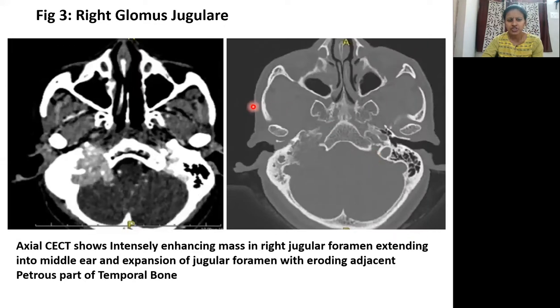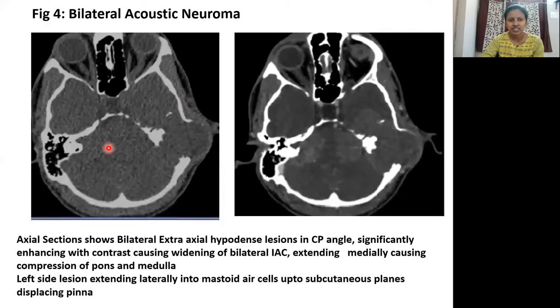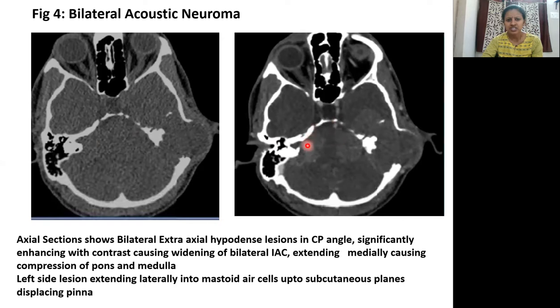This is a case of right glomus jugulare. In this image, we see an intensely enhancing mass in the right jugular foramen extending into the middle ear, and expansion of the jugular foramen with erosion of the adjacent petrous bone. This is a case of bilateral acoustic neuroma. In this image, we see hypodense lesions in the bilateral CP angles. Contrast CT shows enhancing lesions with widening of the internal auditory canal, extending medially causing compression of the pons and medulla. On the left side, we see the lesion extending laterally into the mastoid and subcutaneous plane displacing the pinna.